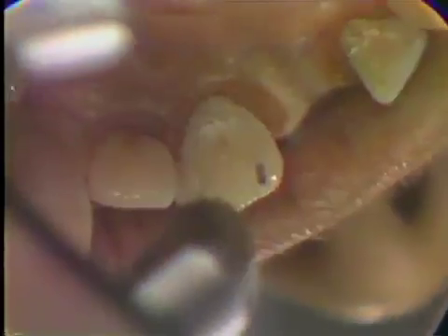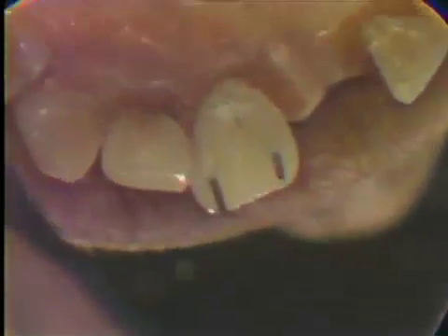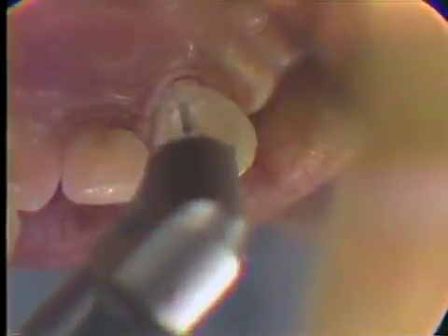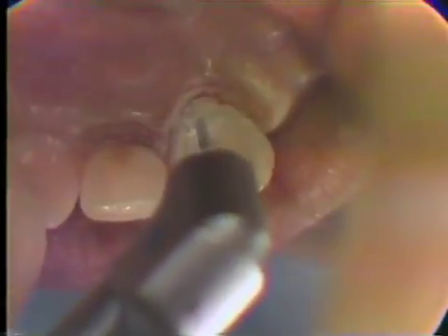Then we will establish our pinhole, making it only a millimeter deep. We'll place another pin in and look at it from the distal and from the lingual. That seems to be in a pretty good line of draw, but it's not deep enough. Now we're drilling the cingulum pinhole. This is drilled to a depth of two and a half millimeters. You'll notice we're using a pumping action on our twist drill, never stopping in the tooth, because this might jam the twist drill.